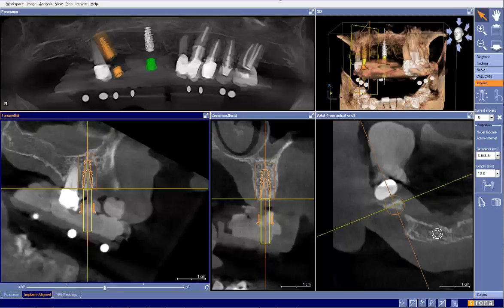Okay, we've been submitting another case here, and here's the note that came with it. Here's the plan for patient X. It's from the text message. This particular dentist and I text back and forth.